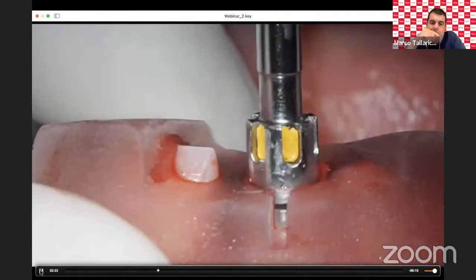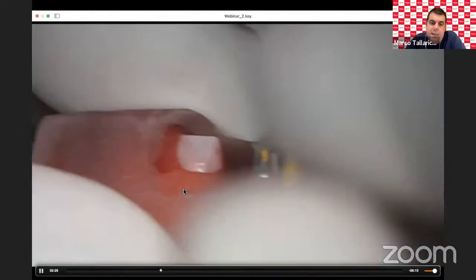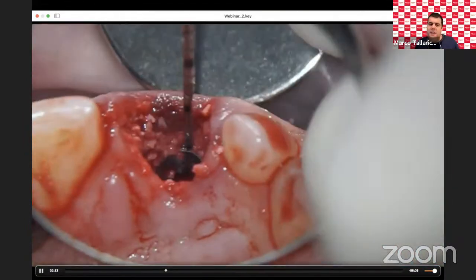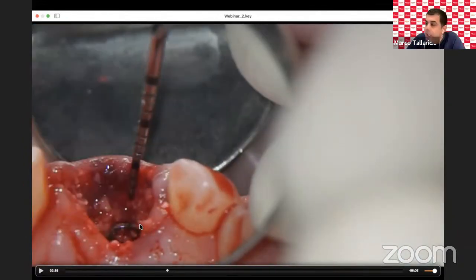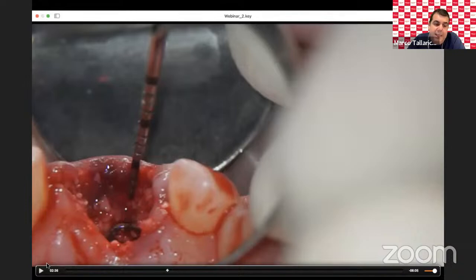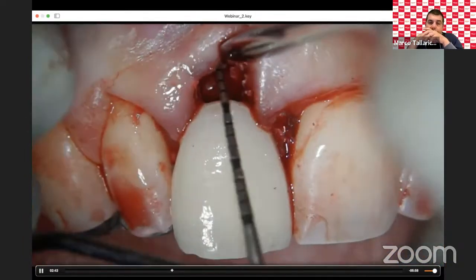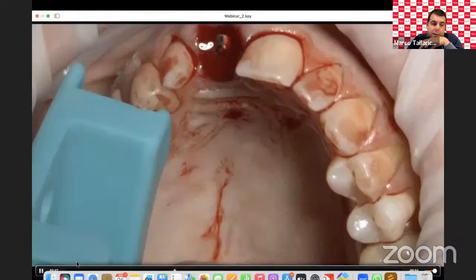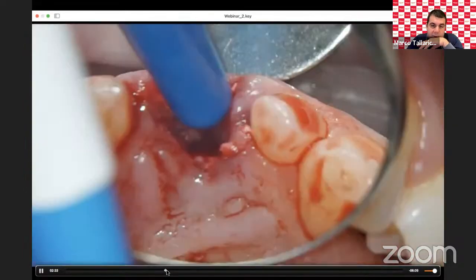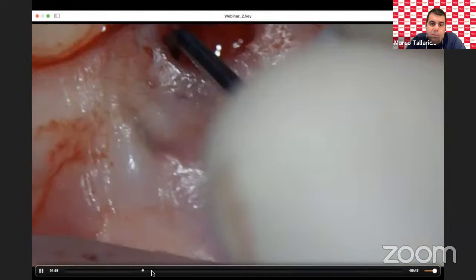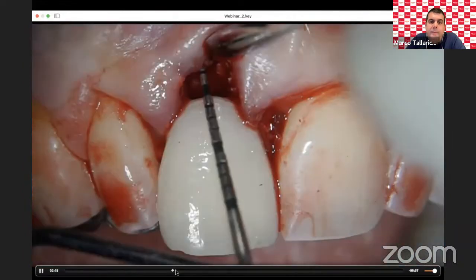The yellow line allows orientation of the internal hexagon — important because I plan immediate loading. I want to rebase the temporary on the implant. You can see the implant, the transition zone at four millimeters, and the envelope I created for the connective tissue graft. I have a Maryland bridge prepared in advance, just in case the implant doesn't have sufficient stability, to cement on adjacent teeth. In this case I use the Maryland to set the position and rebase the temporary on the temporary abutment, then remove the metallic wings and screw the temporary restoration.